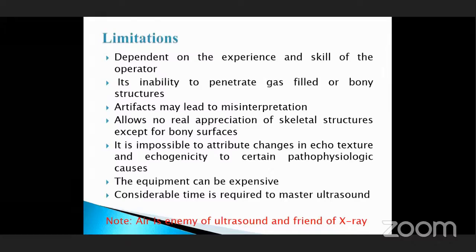It allows no real appreciation of skeletal structures except for bony surfaces. It is impossible to attribute changes in echotexture and echogenicity to certain pathophysiological causes. This means it is non-specific for disease diagnosis. It will diagnose the changes in the internal architecture, but it will not reveal the cause.